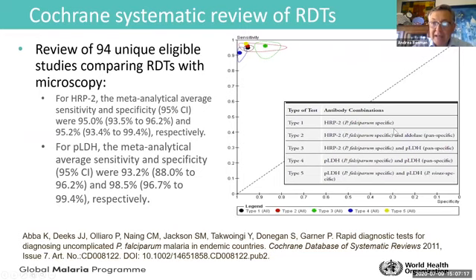And when we look at the evidence, there has been a very thorough and very complete assessment of studies comparing microscopy and RDTs.